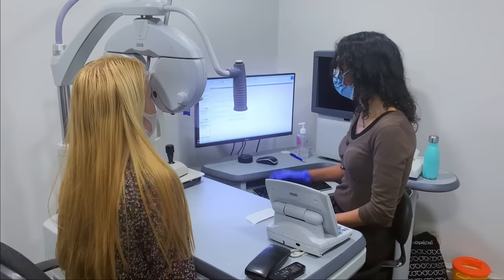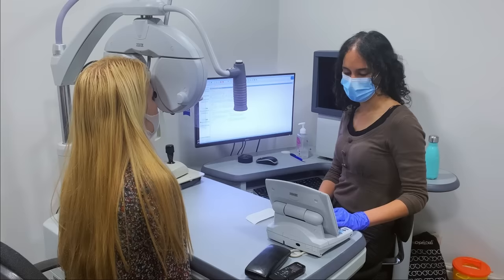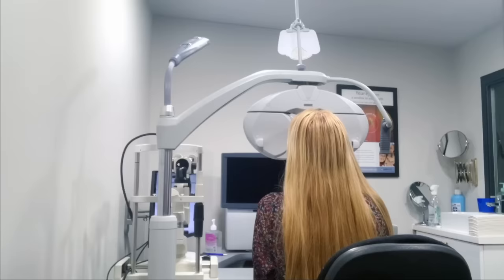So again, looking at the middle line, is it clearer with number one now or clearer with number two? Number one. Good, and then between number three now and number four? Or is number four just smaller? So that was number three and that one's four. I think four is clearer. Okay, good, and then between number one now and number two? Yeah, number one's much better.